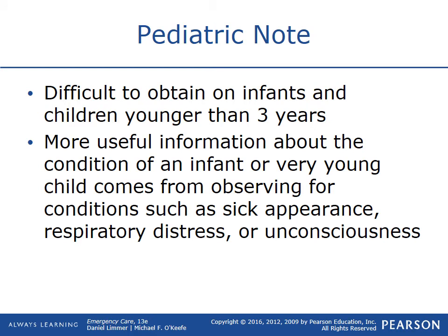Pediatrics are very hard to get blood pressures on. They're squirmy, they're really little, it's hard to hear because mostly all we have is adult stethoscopes. We don't have those little precise pediatric ones. And honestly, most of the time, a kid under the age of 3, it's not a very reliable indicator.